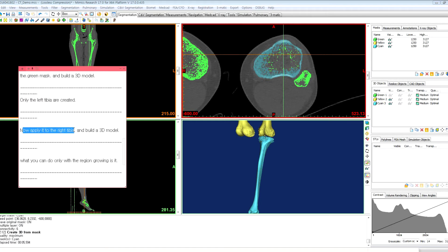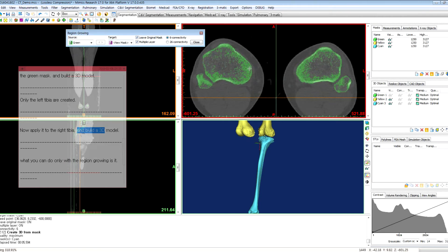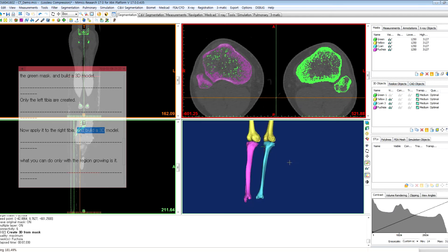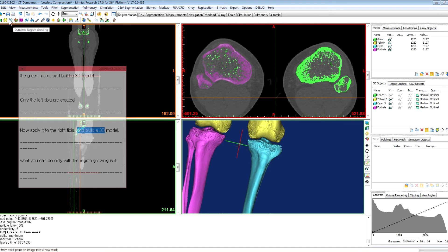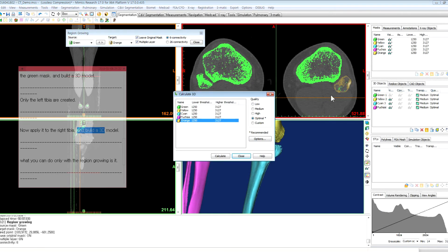Now apply it to the right tibia and build a 3D model. Click region growing and change the source mask to green. Click right tibia and click calculate 3D. And we have the right fibula and tibia. Do it again for the left fibula — change it to green, click left fibula, and calculate 3D.